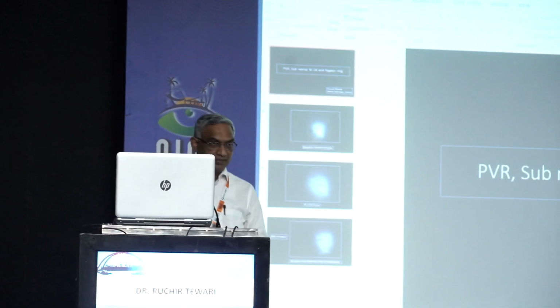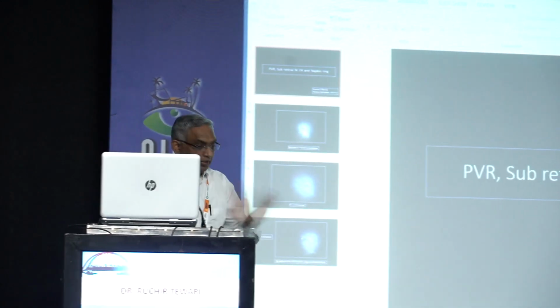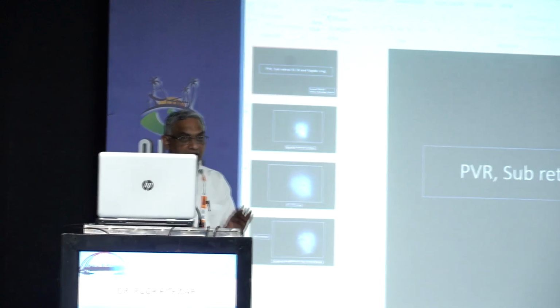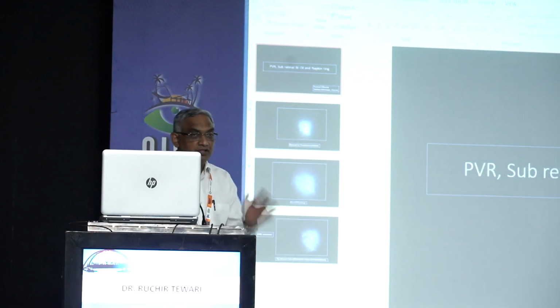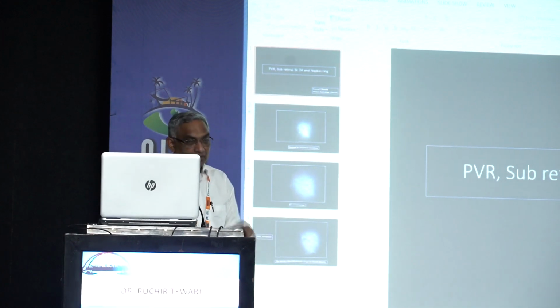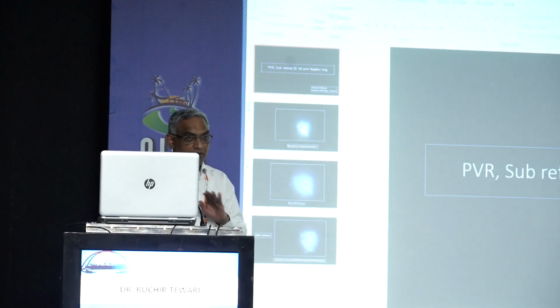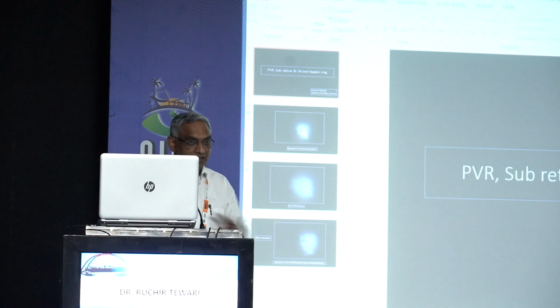No, but then what happens to the capsule? Do you do a cataract or you don't do the cataract? What I do sometimes, suppose the lens is clear, you don't touch the lens. But if the lens is not clear and I don't have a choice but to remove the lens while doing RD surgery or any vitrectomy, diabetics are different when settled down. But in these eyes, I'll try to retain the anterior capsule while doing lensectomy, and polish the capsule nicely. We have incidences where, in spite of that, the capsule becomes fibrotic, but quite some time it stays nicely like that.